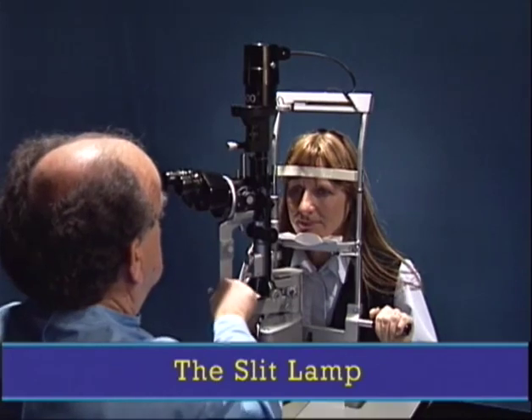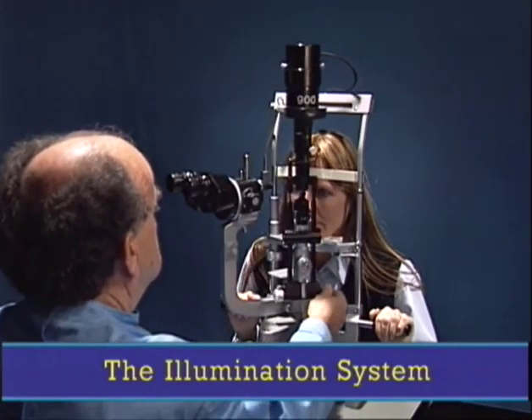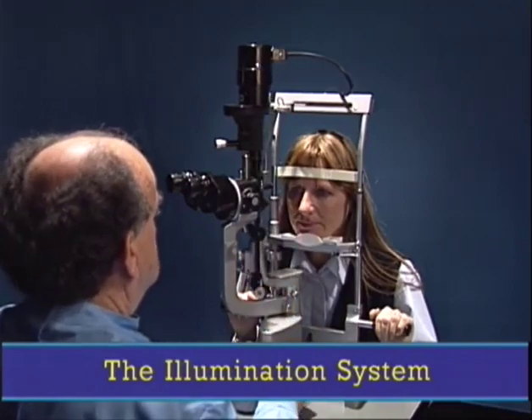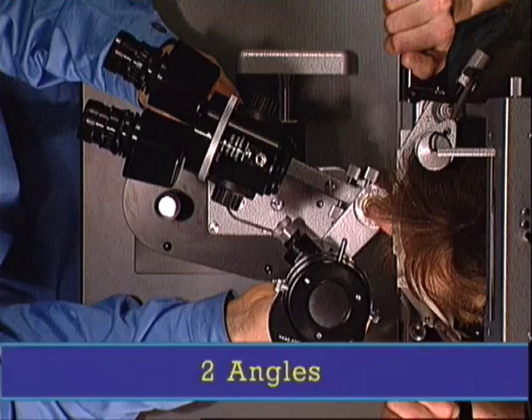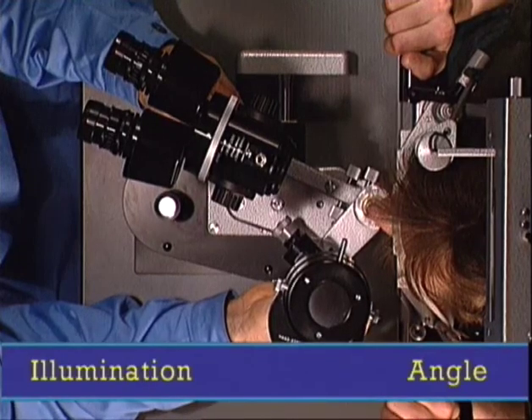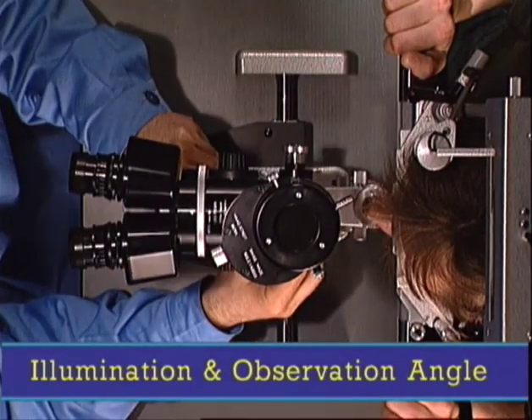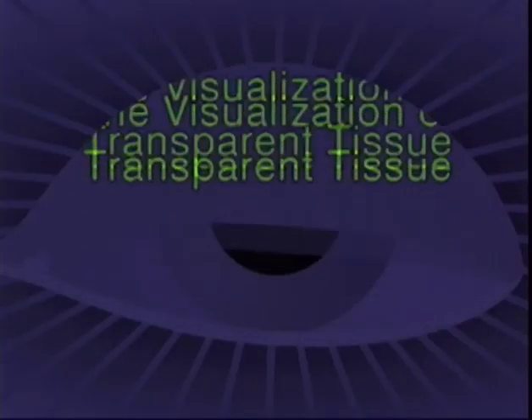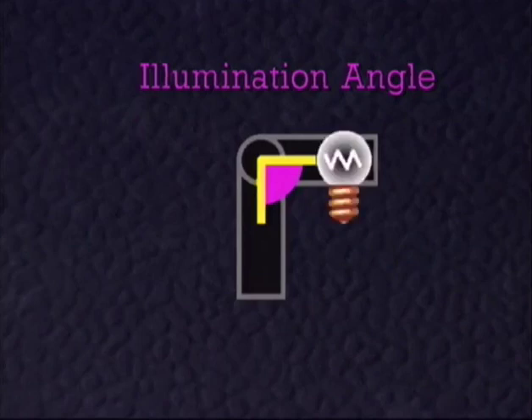The slit lamp has a moving observation system, the microscope, and a moving illumination system, the slit beam. The actions which are used for generating the optical phenomena can be described by 2 angles, the illumination angle and the observation angle. Let us describe first the illumination angle. The illumination angle is the angle between the light beam and the observer, that is, the microscope.